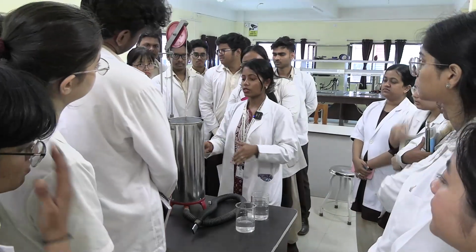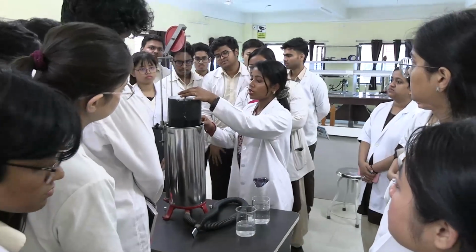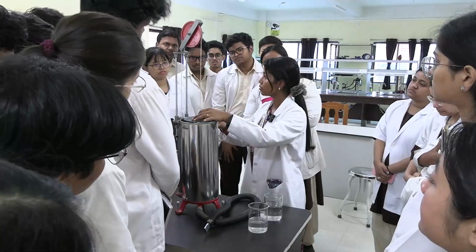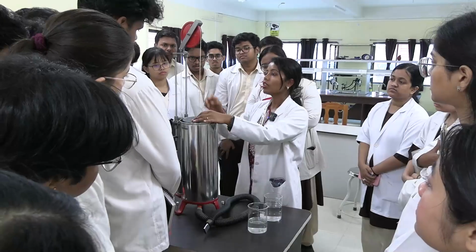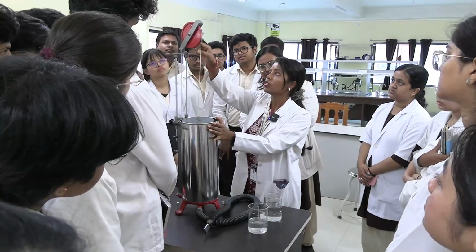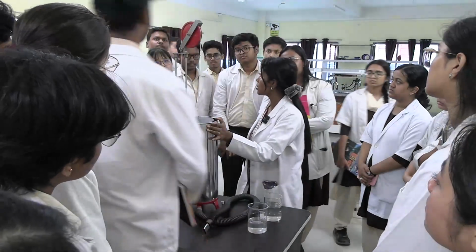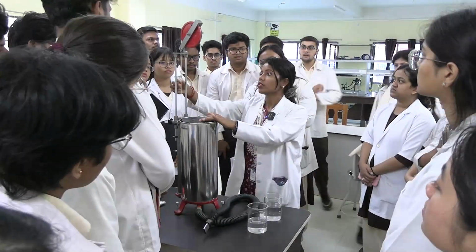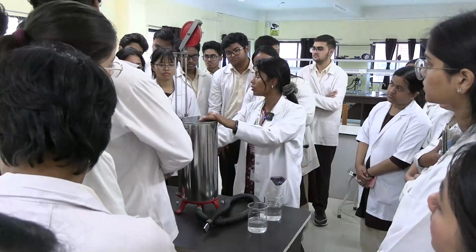What are the parts? I'll tell you first. This is the outer cylinder. This is the inner cylinder, like an inverted bell. Inside you will be putting water; you can see there is water. You need to fill the water three-quarters. The capacity of this bell is 9 liters. And this is the string. This is the dial. This is the pointer. Before performing, you will always have to set the pointer at 0, and it should be flat like this. Then see this counterweight. This is the pulley; inside, one pulley is there. This is the counterweight, which is balanced.